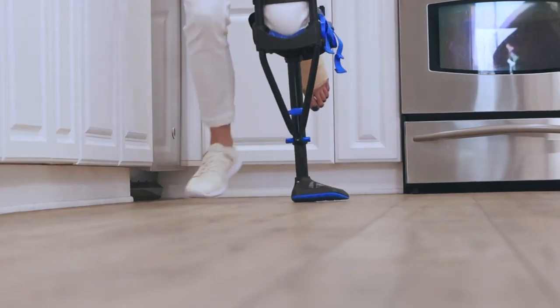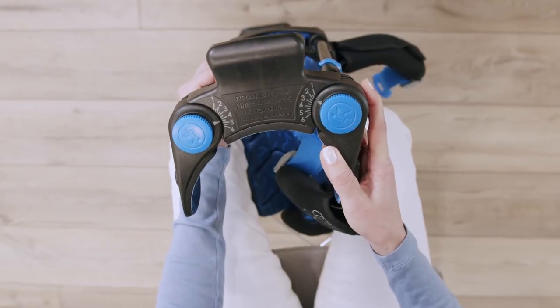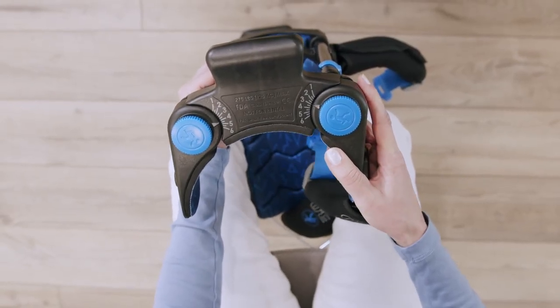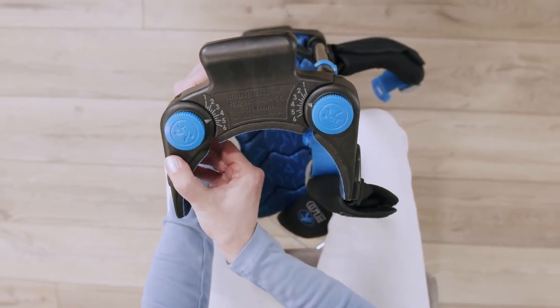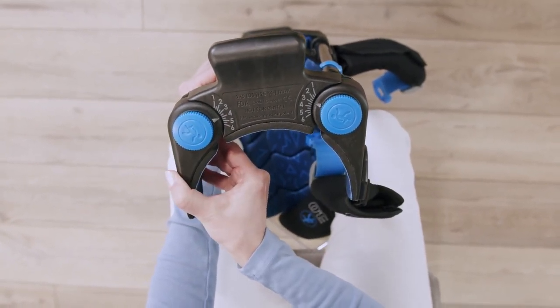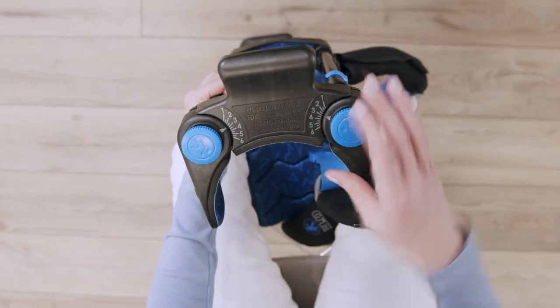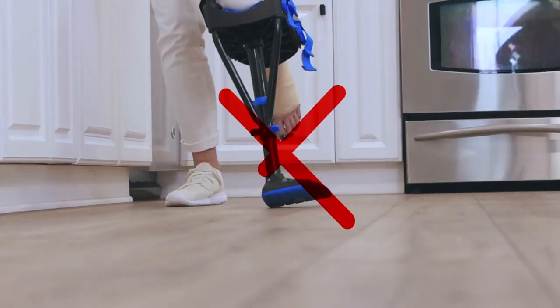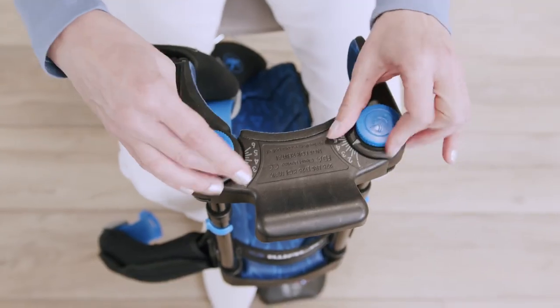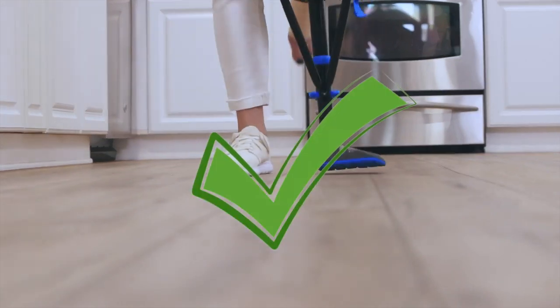If you're walking on the inside edge of the tread, do the opposite. Lift and rotate the inner thigh support outwardly to increase the numbered setting by one. Finish by rotating the outer thigh support inwardly to decrease the numbered setting by one. Then tighten the thumb screws and test your new settings. If you're still walking on the inner edge of the foot, repeat the process until you're walking with the entire width of the tread contacting the ground.